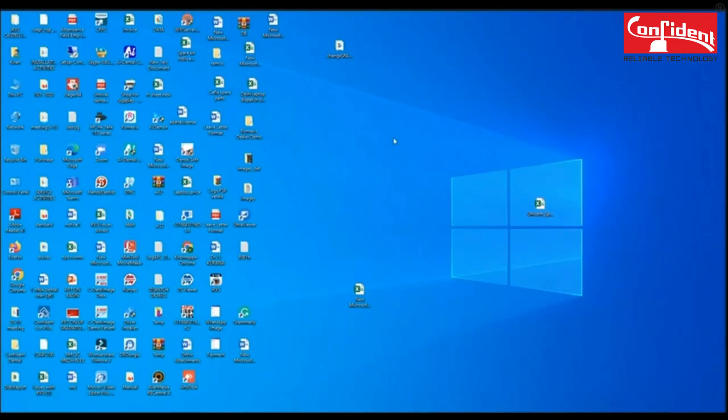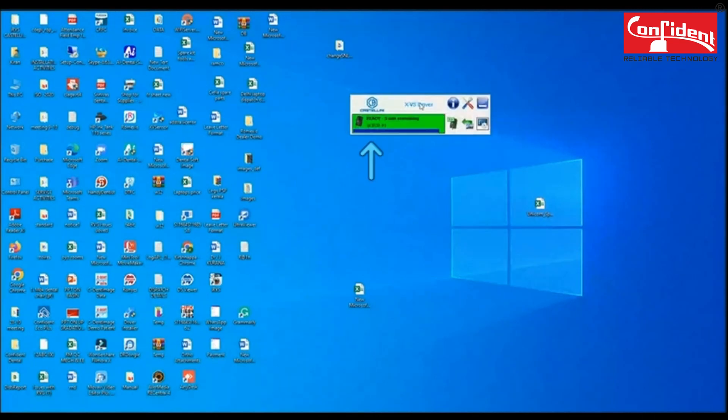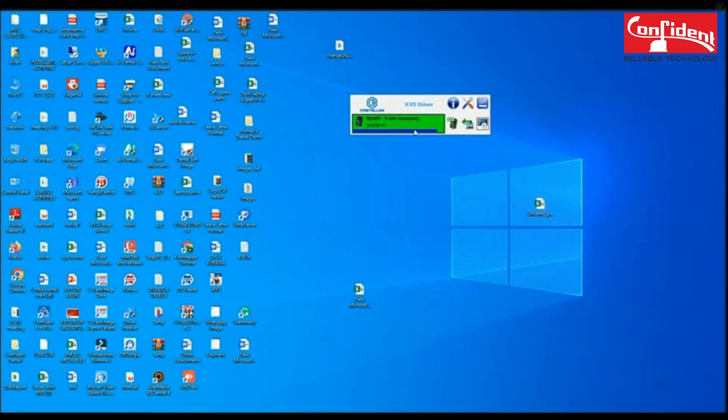As soon as you connect the device to the system, a scanner status pop-up window automatically opens up. You can see that the device is ready to scan.